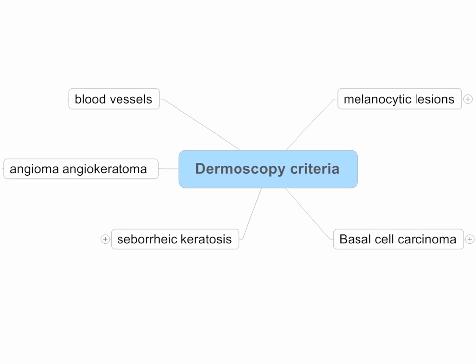We're going to talk about the different dermoscopy criteria and the histopathological correlations. First, we're going to talk about melanocytic lesions — criteria such as pigment network, dots, globules, etc. Then the diagnostic criteria for basal cell carcinoma, seborrheic keratosis, angioma, angiokeratoma, and the blood vessels.